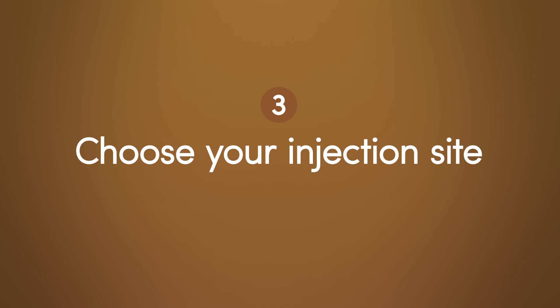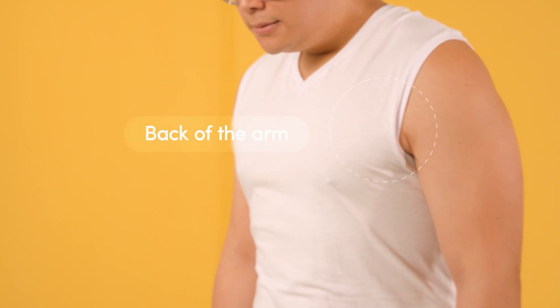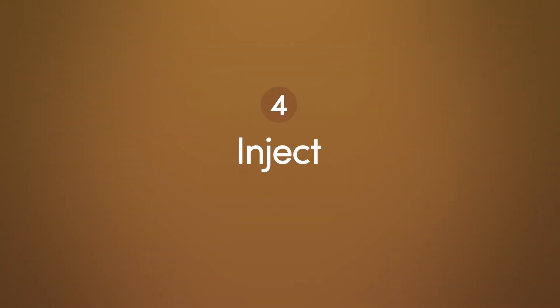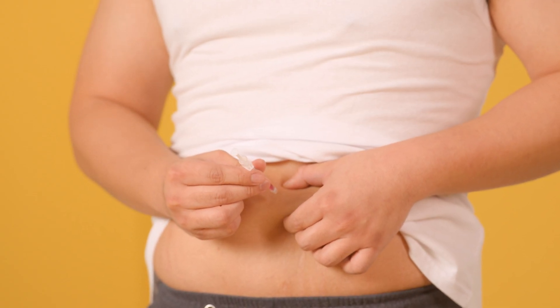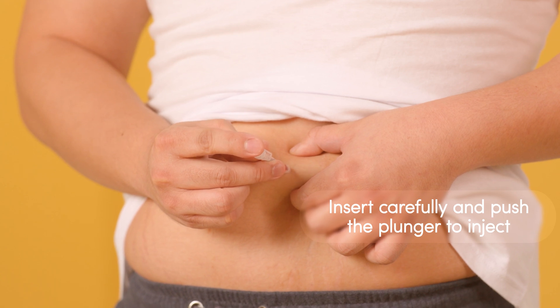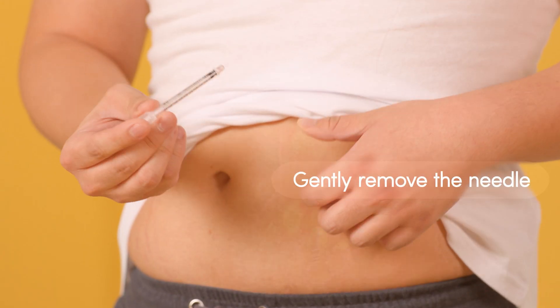Now, select your injection site: the front of your abdomen, the top of your thigh, or the back of your arm. Always inject directly into bare skin and consider alternating sides each week. You're now ready to inject. Hold the syringe between your index and middle fingers with your thumb on the plunger. Position it at a 90-degree angle to the skin. Carefully insert the needle all the way into your skin — avoid jabbing — and slowly push the plunger to inject the medication. Once all the medication is injected, gently remove the needle from your skin.